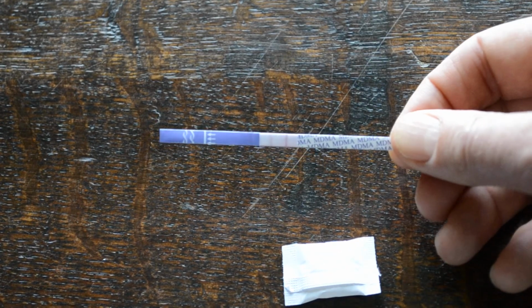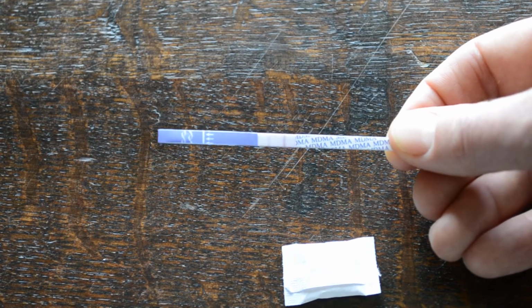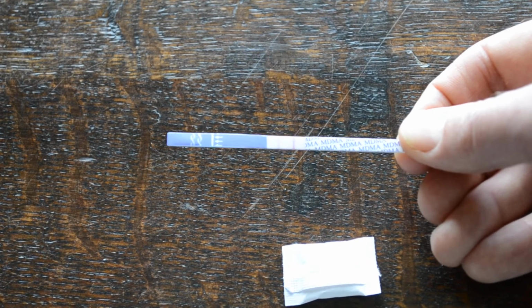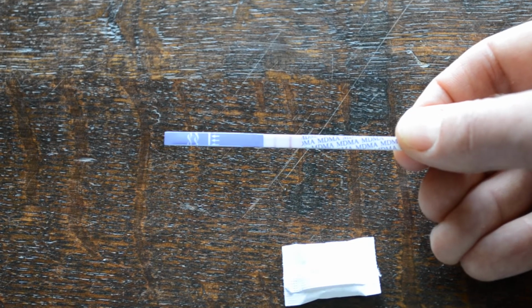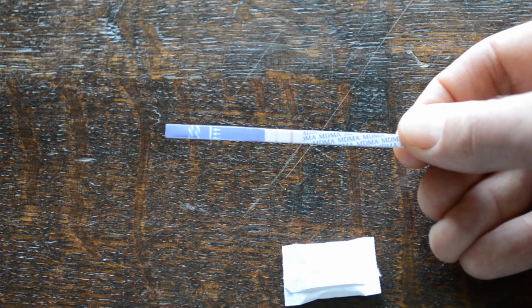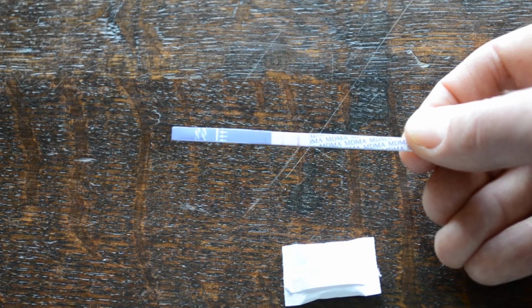So I think what you'll see already developed on this test strip is both a control line and a test line. Now they will continue to develop over the course of 3 to 8 minutes, and what you'll be left with is a completely white background and 2 very nice well demarcated lines. So the interpretation of these is very clear and easy to do. You're looking for 2 test lines as a negative result, a control line with no test line showing at 8 minutes as a positive result. So very easy to interpret.